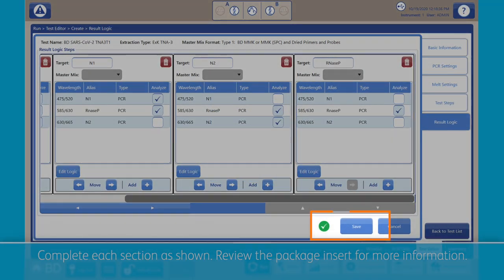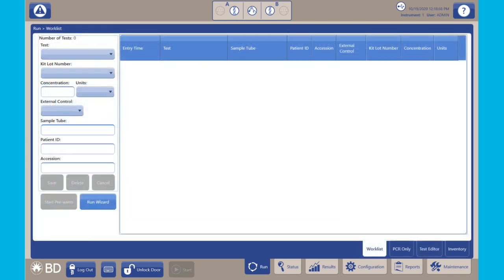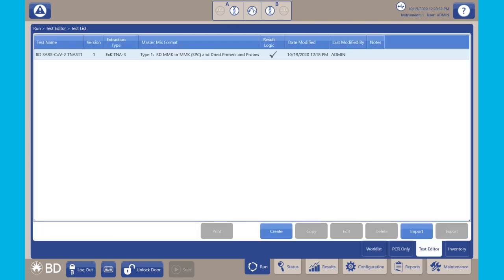Click Save after all information has been entered into the Test Editor. The UDP only needs to be created once and can be used for subsequent runs.